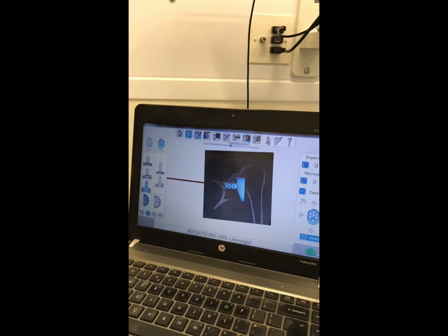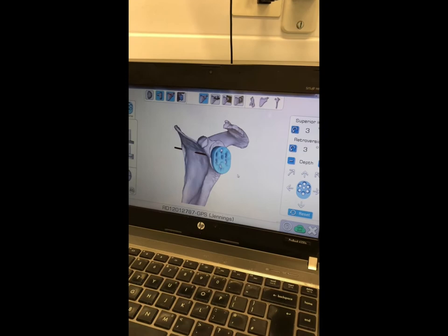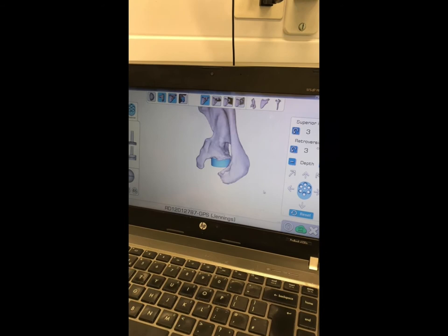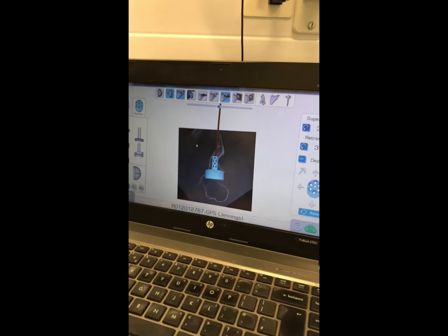And what we will hopefully end up with, to rotate it with good contact, good superior tilt, and very little overhang, and adequate bone stock for good fixation. And there's no perforation front or back with the peg, as you can see here.